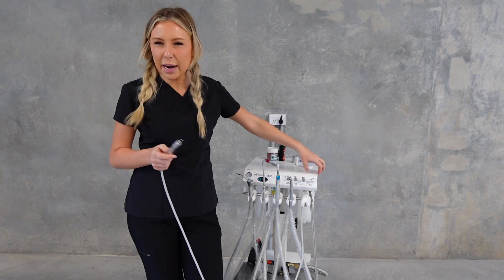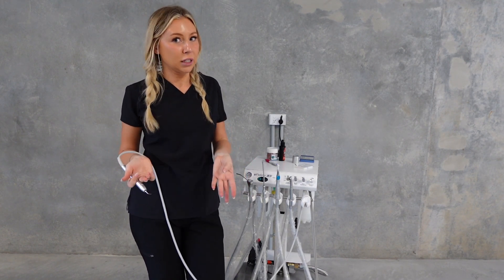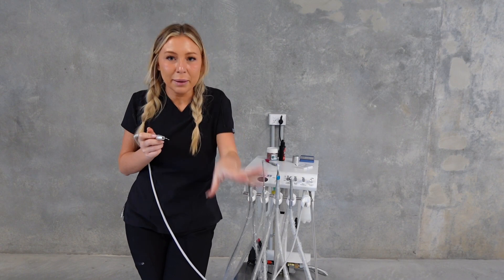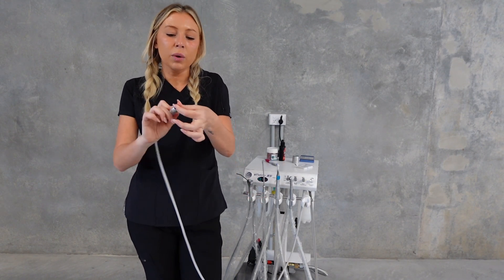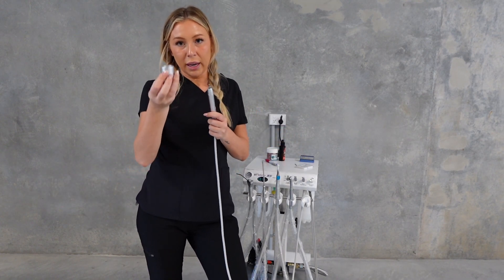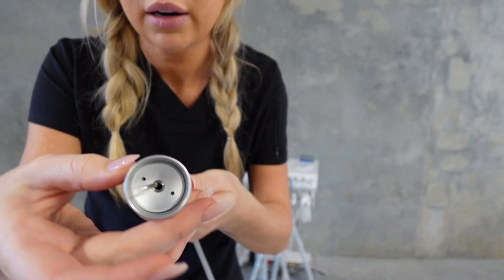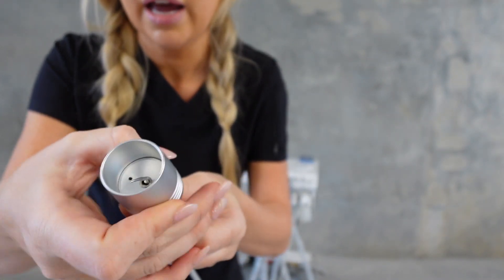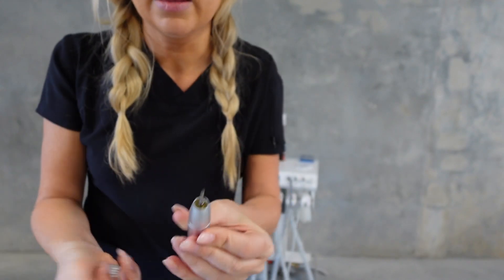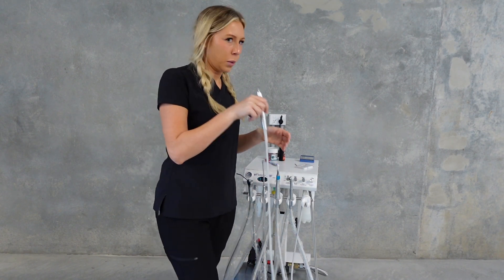If you've checked the settings, upped it, and you're just not getting a really good clean - check that your scaler tip is tight enough. I find this works probably 80% of the time. It hasn't been tightened - you feel it and think it's nice and tight but it's not. Make sure you're tightening it at the start of every day as part of your routine. Get a tightener like this, match up the hole, insert it down, and tighten it firmly before removing.